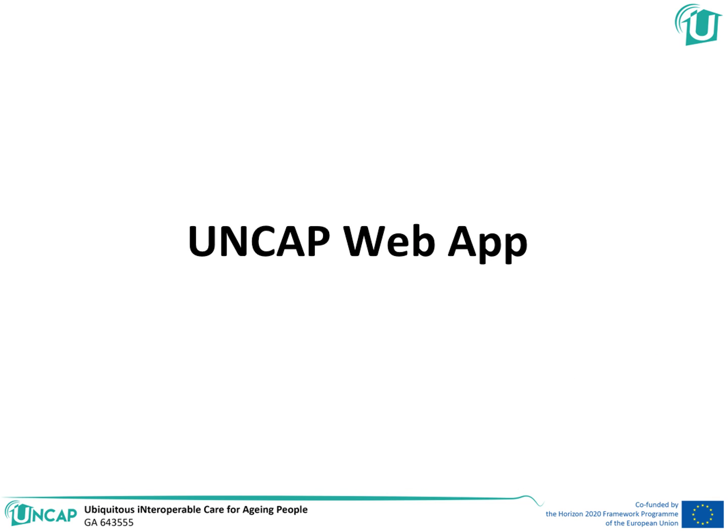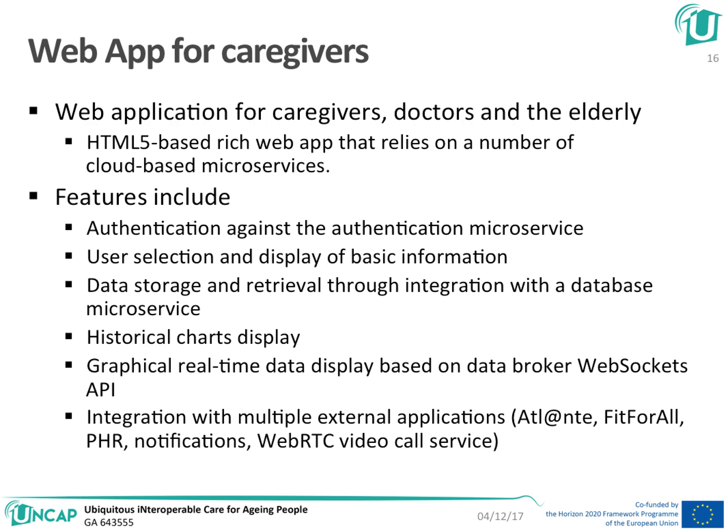Now another big piece on the other side, on the caregiver side, is the UNCAP web application. This one, of course, can be used by caregivers, doctors, or even the elderly or the next of kin. It's an HTML5-based rich web app that relies on a number of cloud-based microservices for fetching the data, authentication, and so on.